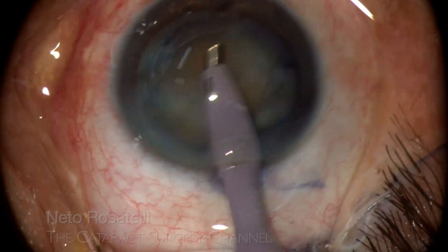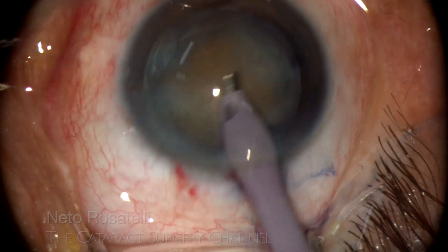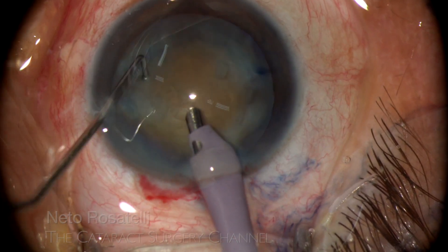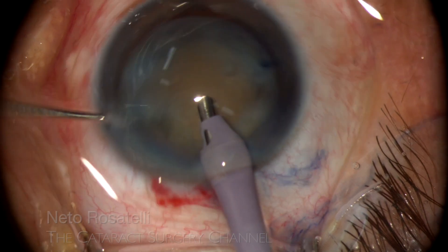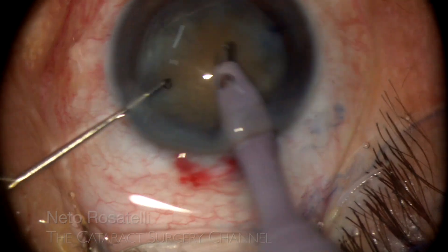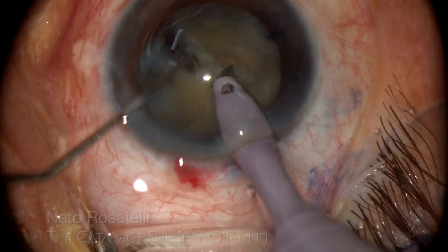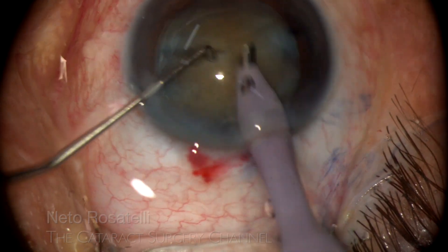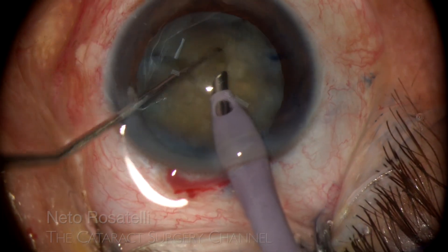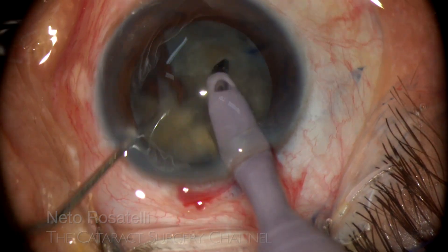As I make the incision in the posterior limbus, chopper opening is needed to avoid ballooning. And now comes a maneuver I find very useful: the nucleus spin. It may seem overkill and aggressive, but it isn't. If you watch carefully, you see that the bag is completely still with no radial force whatsoever applied to the zonules. It took me 8 seconds to loosen the nucleus and spin it 6 times in each direction, applying the fulcrum principle, which is one of the most important skills for the surgeon to master.